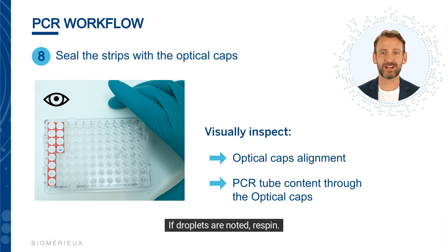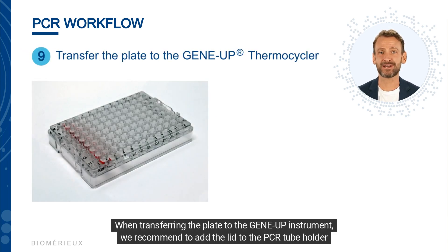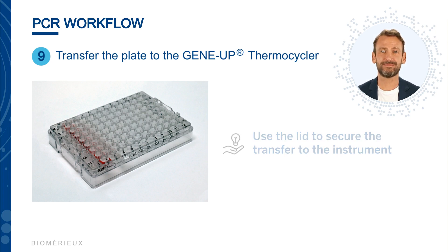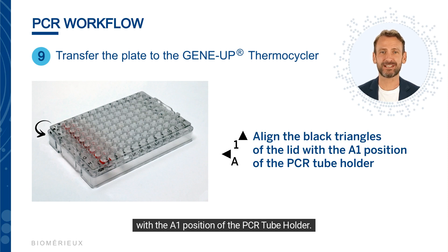Visually inspect that the optical caps are flush with the PCR tube. Check the contents of each PCR tube through the optical cap for liquid color, volume, and any sample droplets adhering to the side of the tube. If droplets are noted, re-spin. When transferring the plate to the GeneUp instrument, add the lid to the PCR tube holder to secure the tubes. Align the black triangles of the lid with the A1 position of the PCR tube holder.